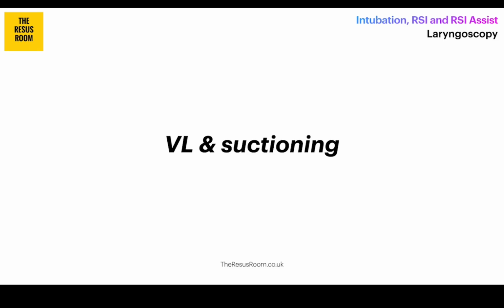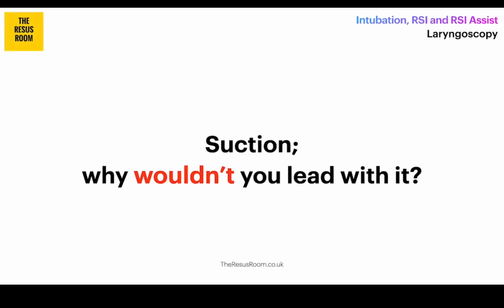And there's obviously lots of nasty things which can try and stop that camera working. So stuff like saliva, blood, vomit, and even in not heavily contaminated airways, if you're going to get any of that on the end of the camera, then that's essentially your video gone. So you need to have a really good think before you're intubating that patient about why, if you're using video, and in fact, actually with direct as well, why you wouldn't want to have suction in your right hand and really clean up that airway.